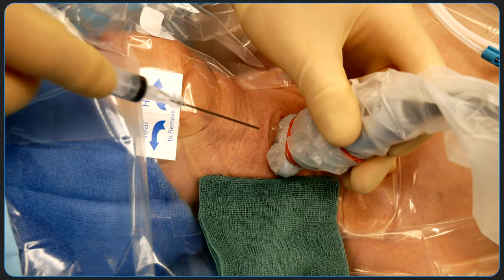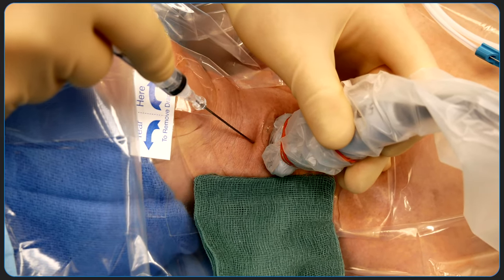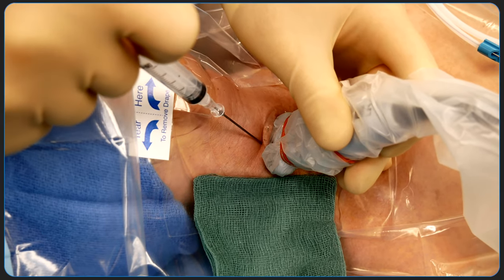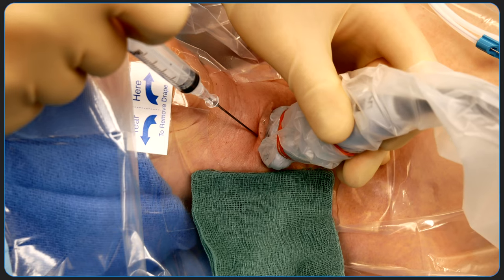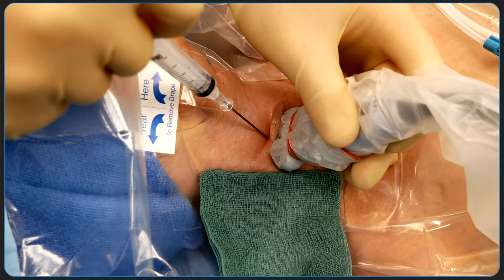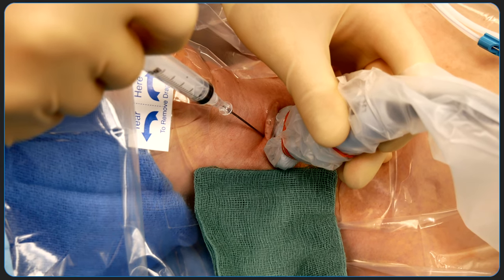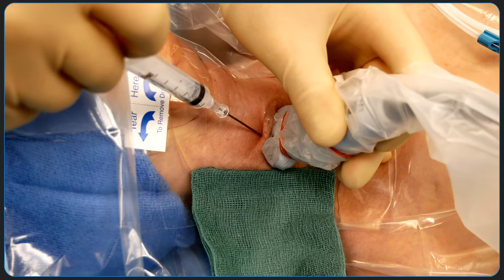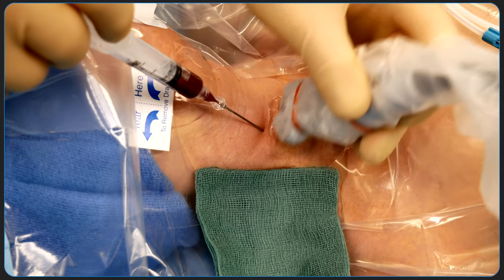With an out-of-plane technique, the ultrasound is oriented perpendicular to the trajectory of the 18-gauge introducer needle loaded on a syringe. Alternatively, an 18-gauge angiocatheter may be used in lieu of the needle. The needle is advanced with continuous negative pressure on the syringe until venous blood is aspirated. Subtle and deliberate jabbing movements may be carefully performed to traverse the vessel wall.